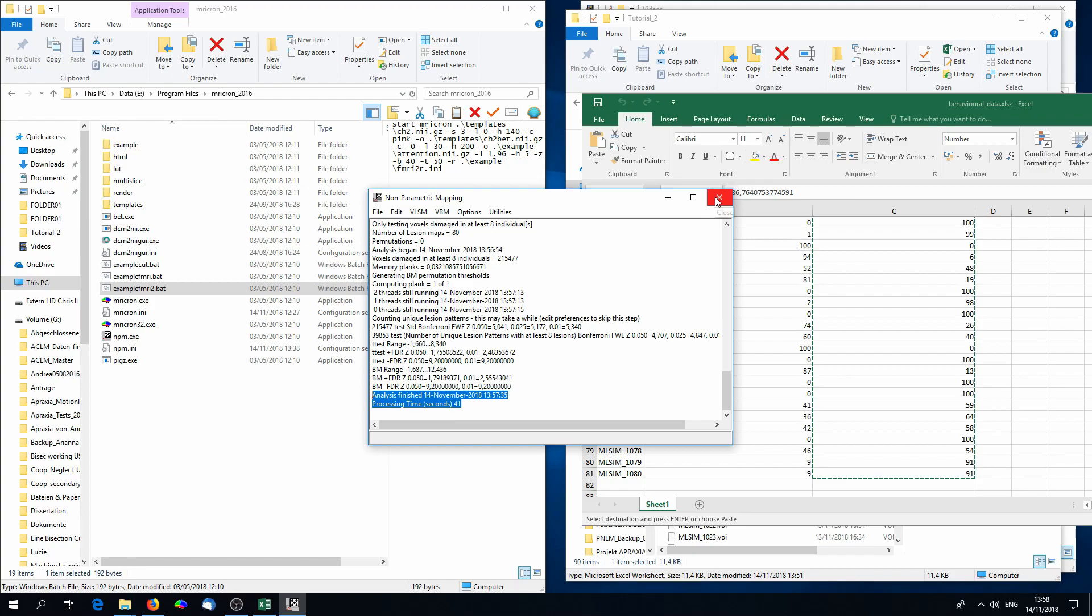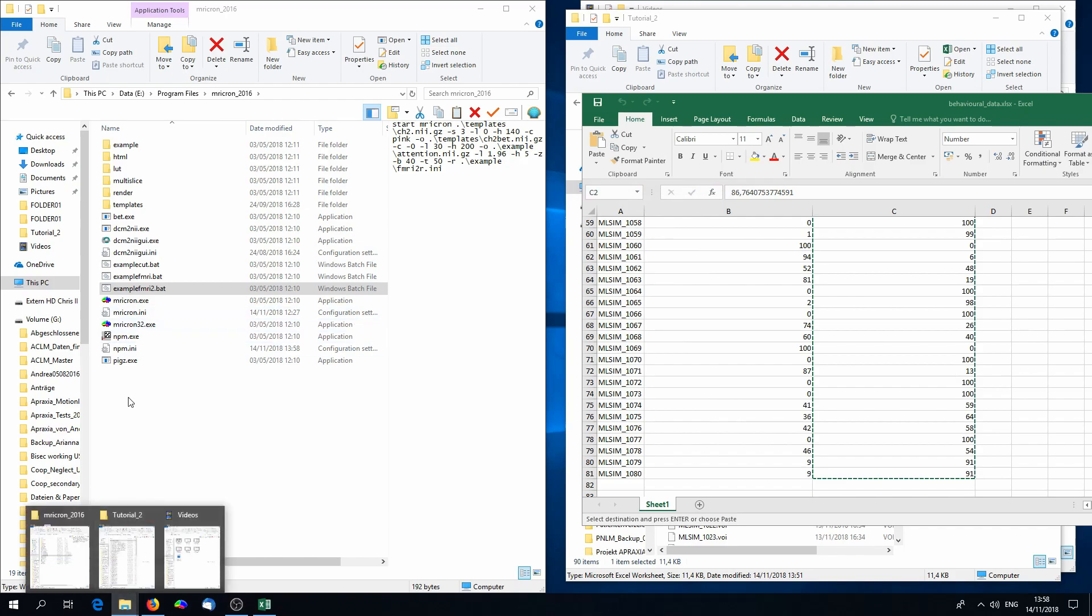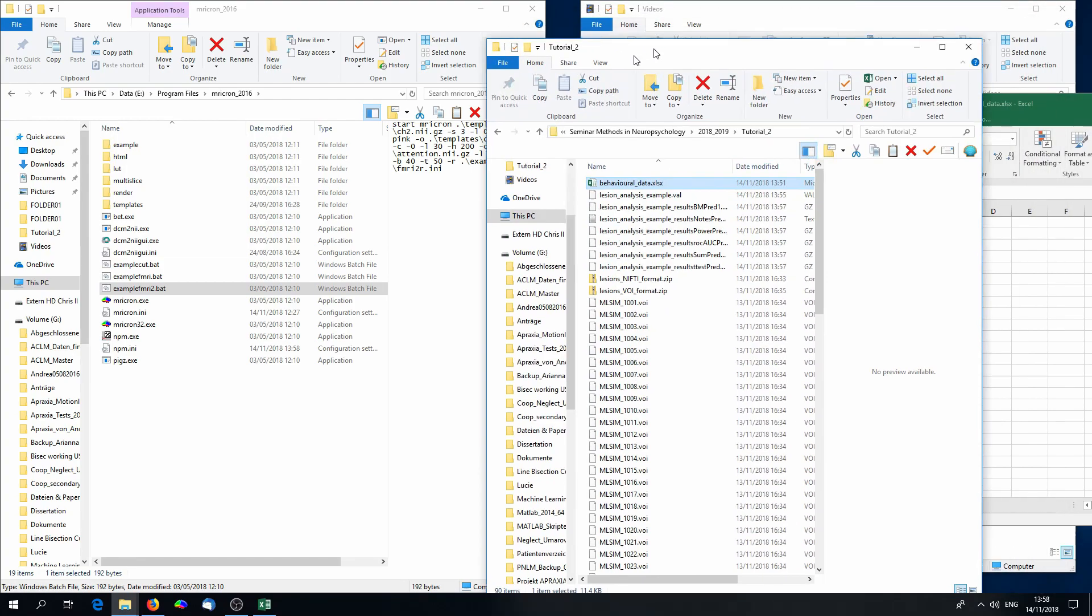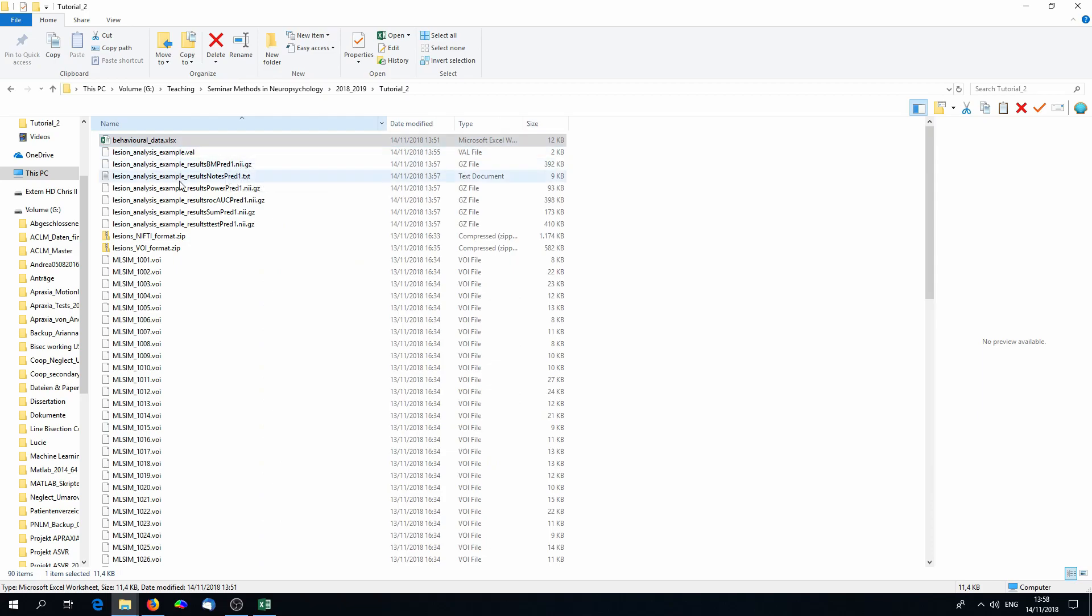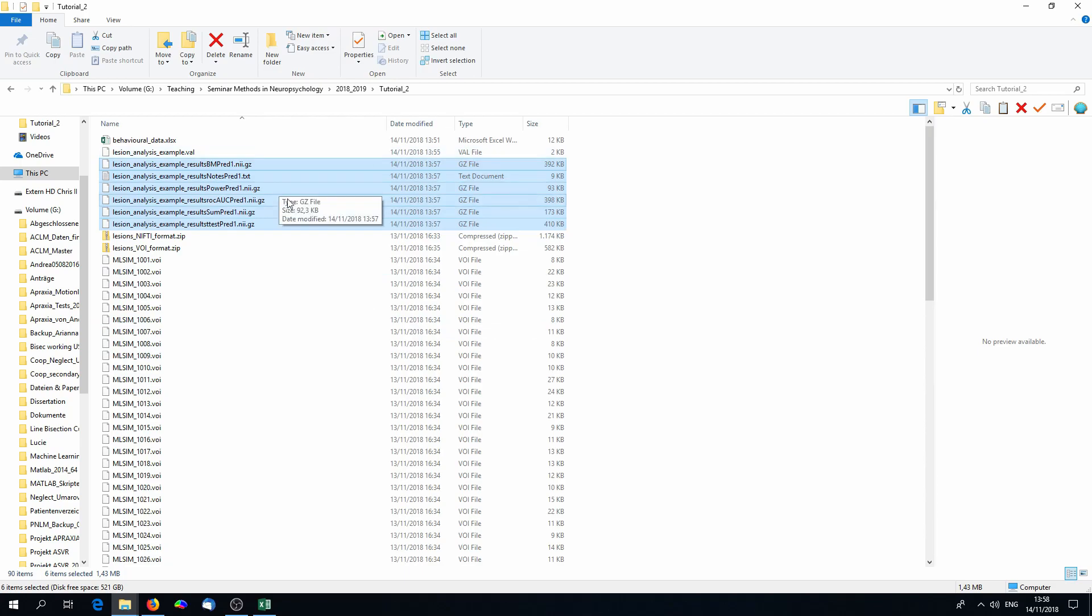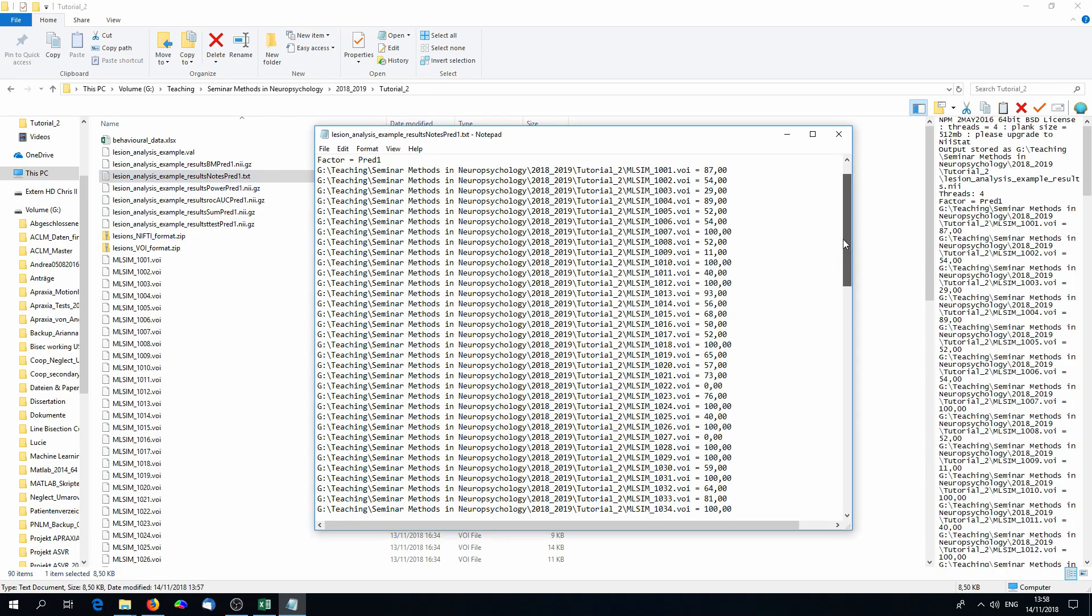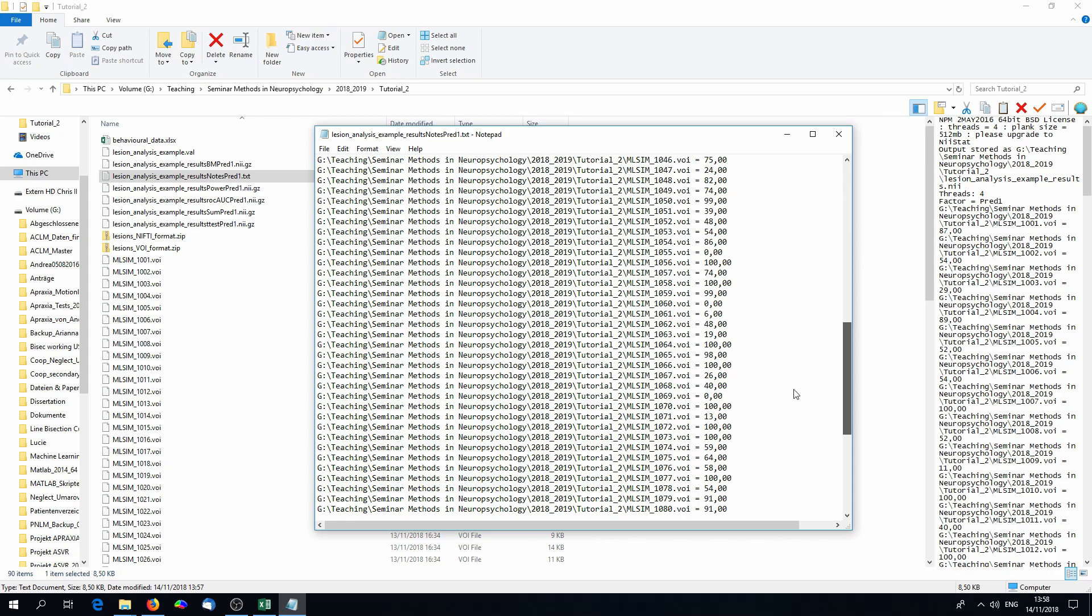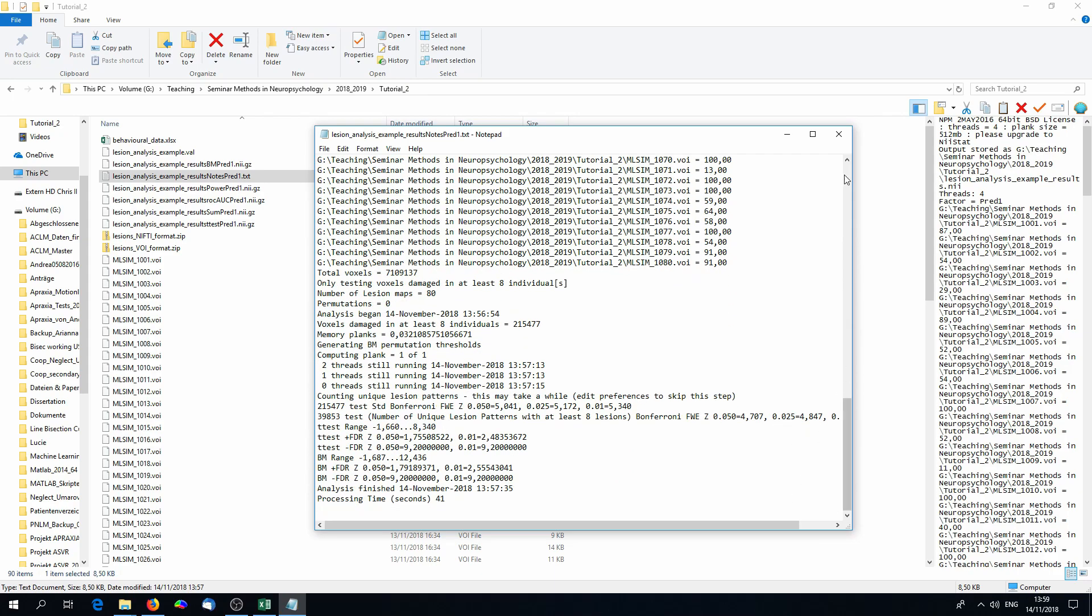Now, you can find in the folder where you placed the .val file several new files that were produced in the analysis. There are three files that we actually need now. This is results.bm, that's Brunner-Munsel test, results.t-test, and a .txt file. The .txt file is very central to everything. Not only you will find information on what we put into the analysis, and for example, how often a voxel had to be damaged, but also the results.